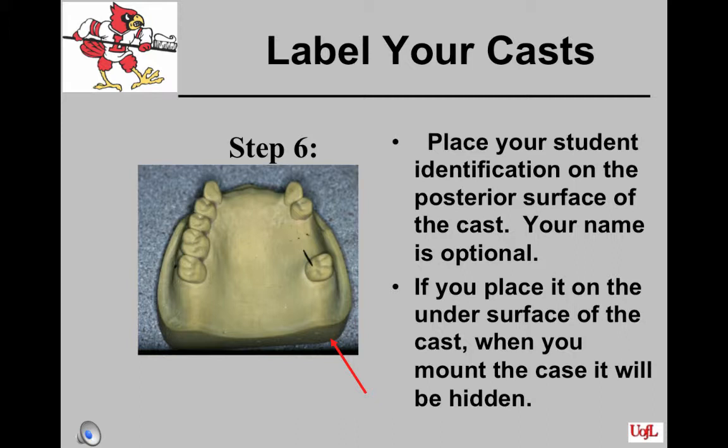If you place it on the undersurface of the cast, remember though that when you go to mount it, it's going to be obliterated and hidden once the case is mounted.